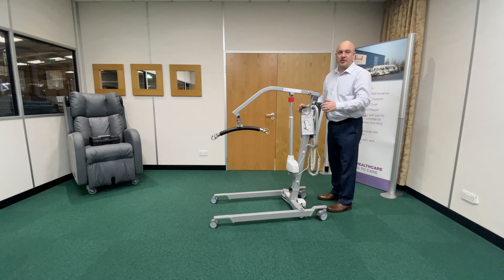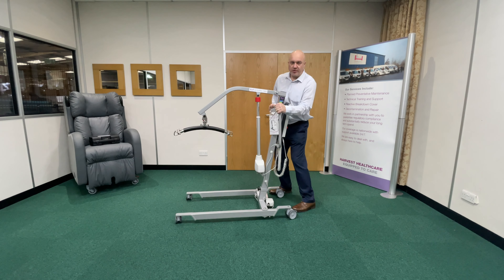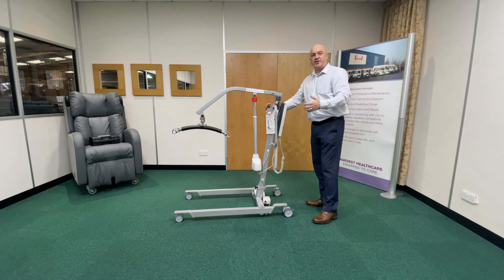So that's going to save a lot of stress and strain on care staff and family members who are trying to operate the hoist and turn direction. The other big tip for you is when you're changing direction with the hoist.